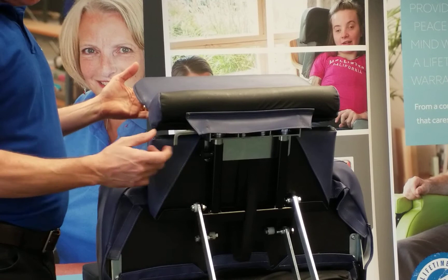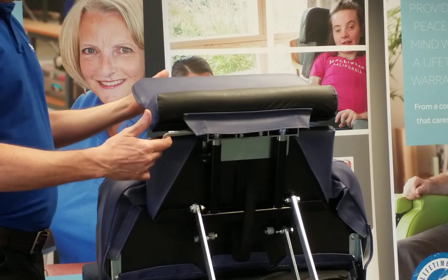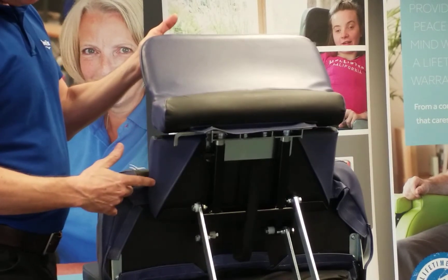The footplate is also angle adjustable, so again pull the lever towards you, move to the desired position, release and it will lock in place.